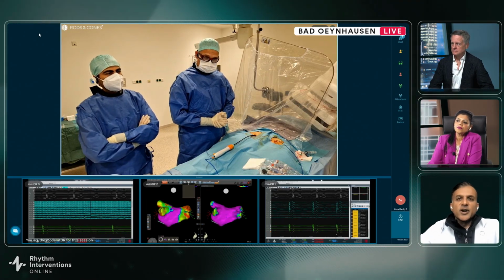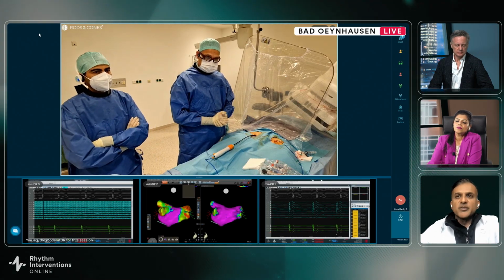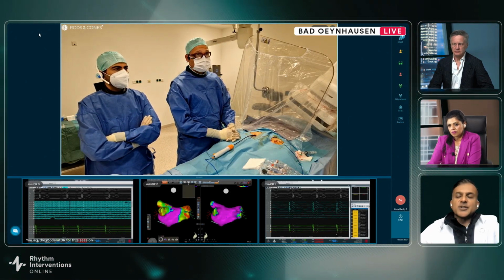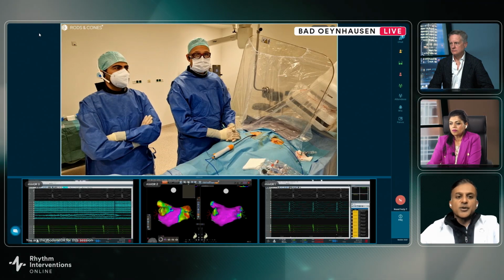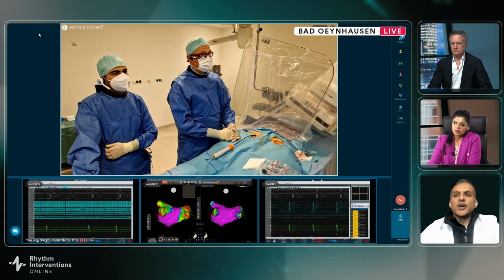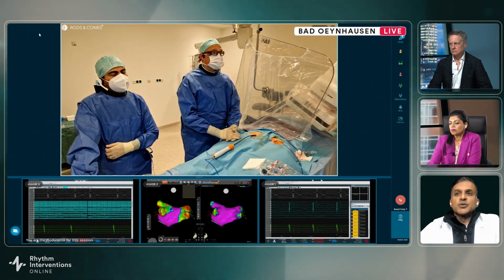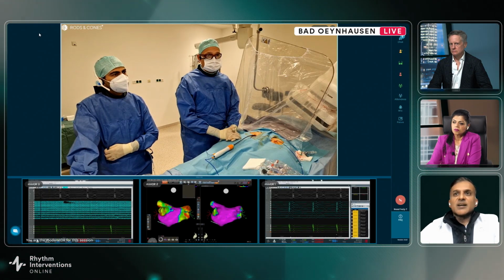I think it's an extraordinarily efficient tool for a PAF patient because it's well suited for the veins, kind of a belt and suspenders. You get the ostial lesions, the antral lesions, and those ostial lesions also really get the carinas quite well. So you hit the carina from both the upper and the lower veins. So I think you get very durable PVI. The fact that it has TPI allows you to be very confident on contact without necessarily needing ICE.